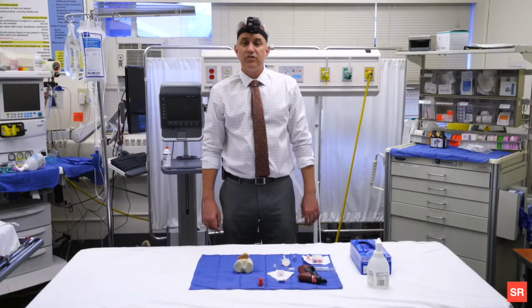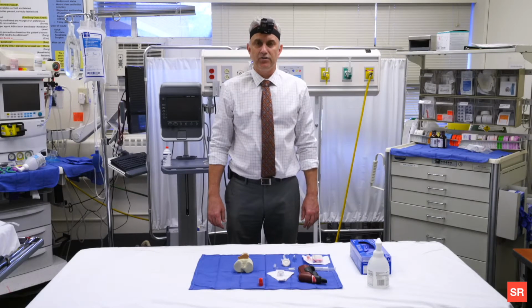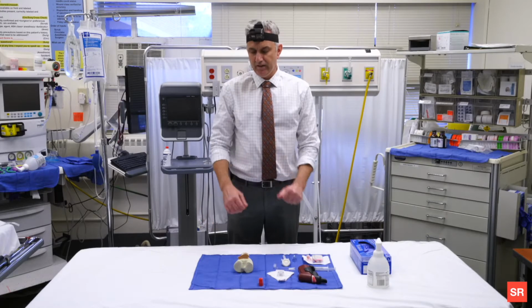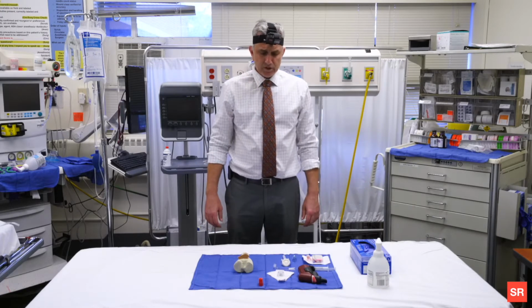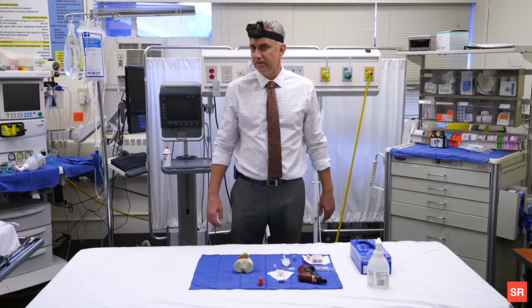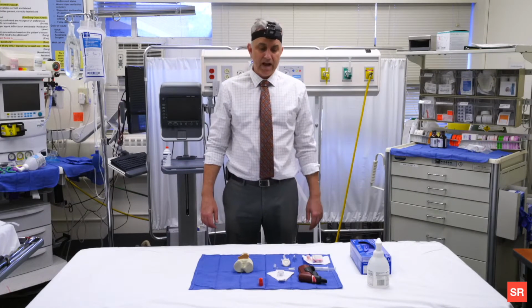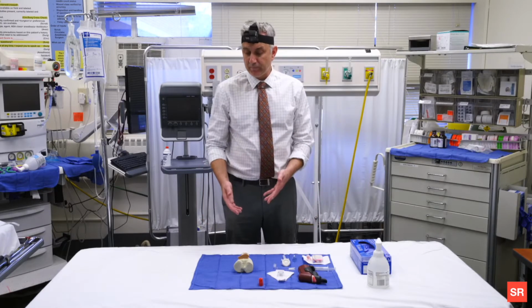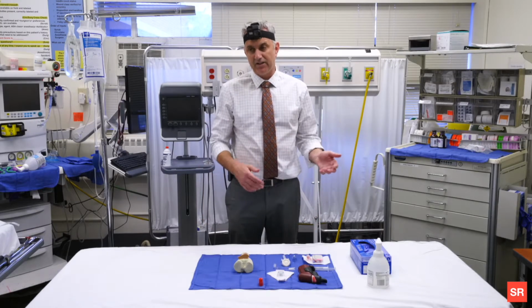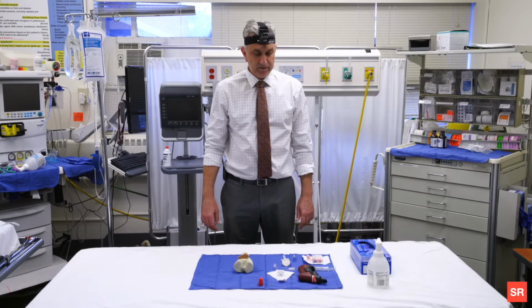All right, so today I'm going to be demonstrating the placement of an intraosseous needle or introducer into a pediatric patient in the tibial bone. So the first thing I'm going to do is, if my license requires it, check and see if I have a physician order. If there is a physician order, great. I'm now going to come back and identify that I have the correct patient by checking the name band, and that matches the order and matches the person who I think I'm going to do this procedure on.